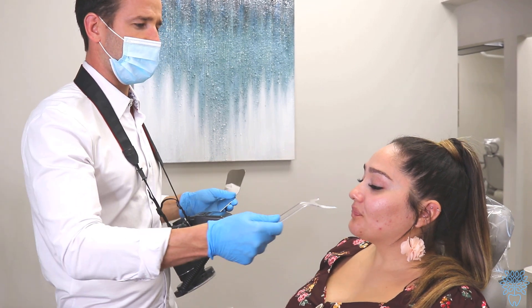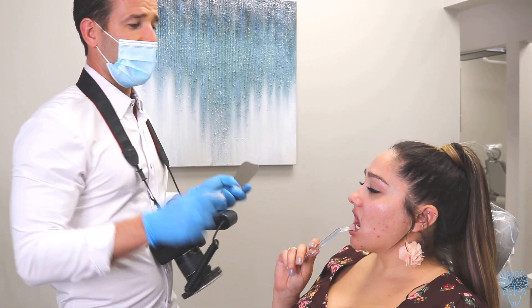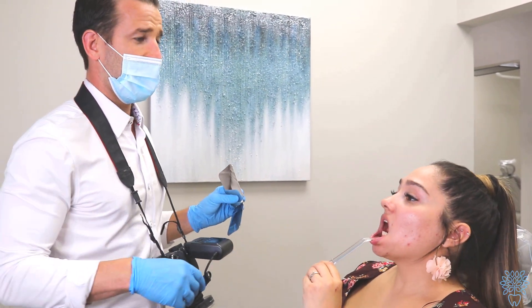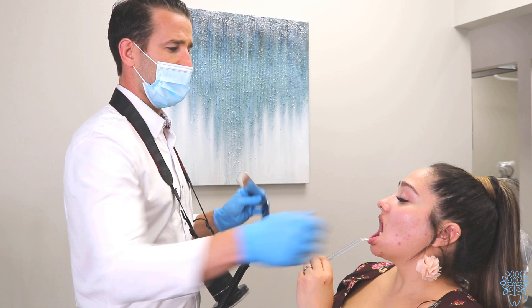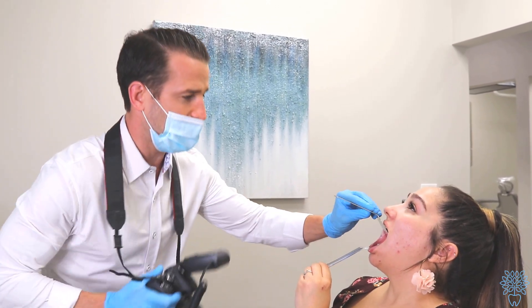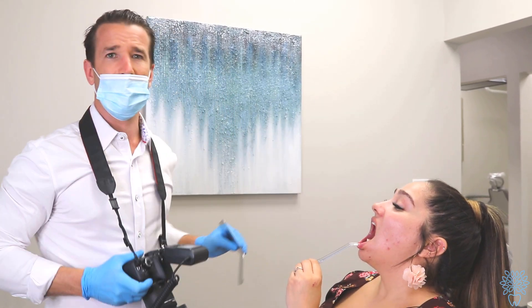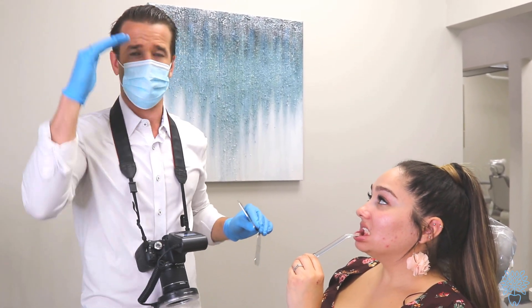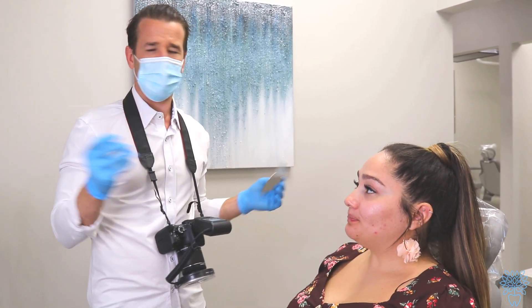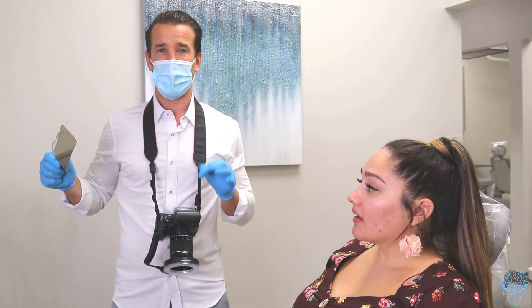Take this out and do the same thing on the bottom. For the bottom ones, I always have them tilt their head back a little bit. Have them look toward you, tilt their head back more, go in there straight on touching the teeth, and take the picture. It's going to look very vertical — like it's coming straight down on the teeth. Some people think this is really tough, but it's straightforward.